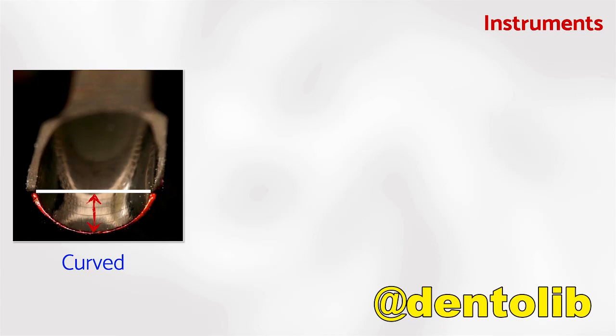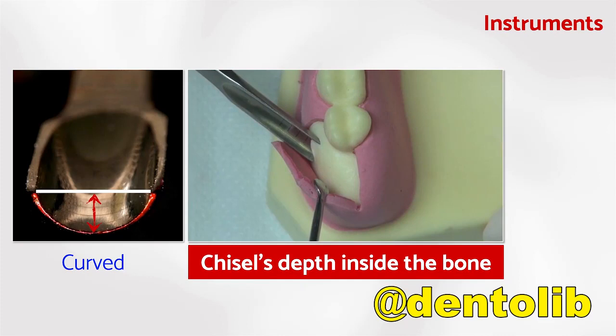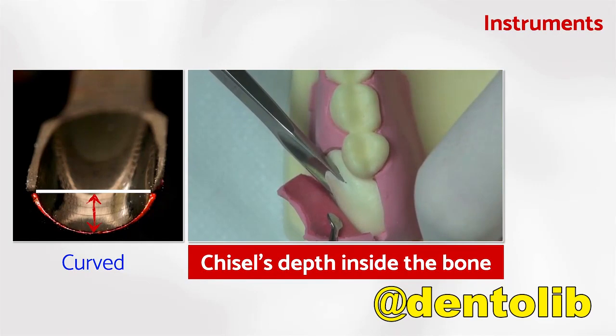When we see from the tip of this tool and we put a flat surface exactly from one of the edges to the other edge like this, you can see exactly the height of this active part of this tool. And how important it is, because it will guide the thickness of the bone to be harvested from the donor site.